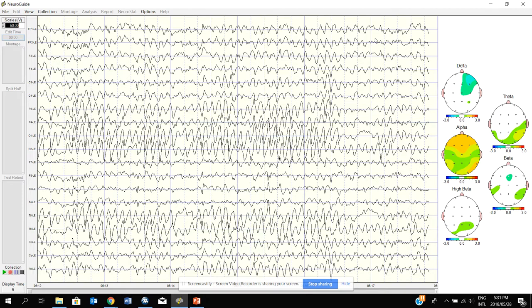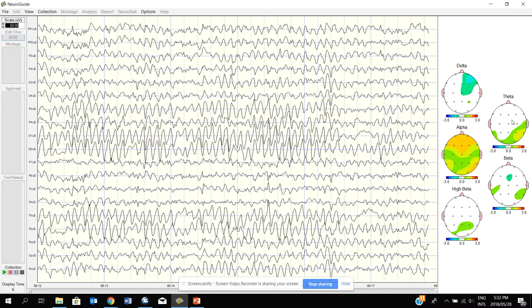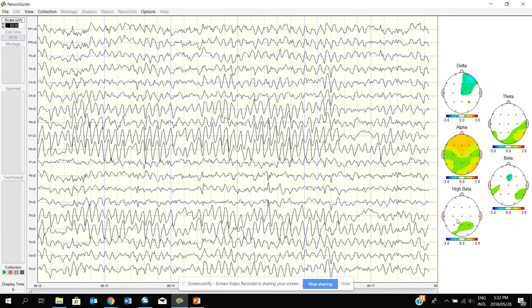For each of these lines, we can split the electrical activity into categories which we call frequency bands. It's just for convenience. So we're looking at a range of electrical activity from one to 30 cycles per second, but we classify it into different groupings like delta, between one and three cycles per second. And then this head represents all those brain waves at each of these positions, which cycle between four and eight times per second. We call it hertz per second. This head represents the waves which cycle between eight and 12 cycles per second. This one represents 12 to 25, and this one represents 25 to 30.